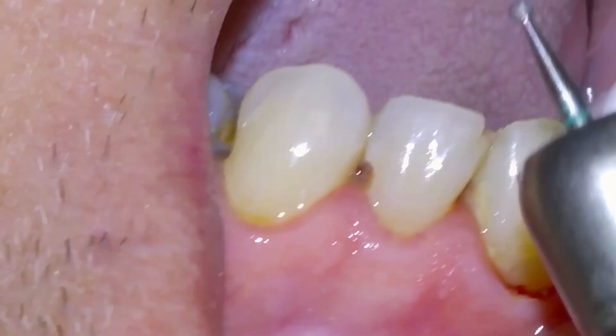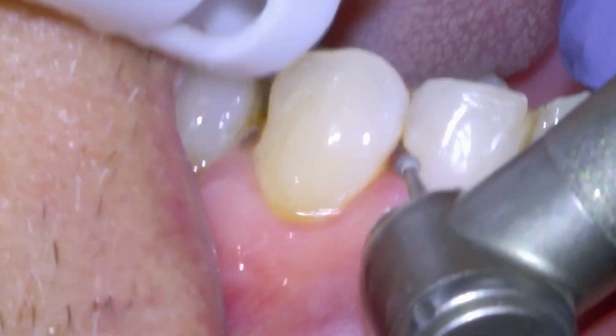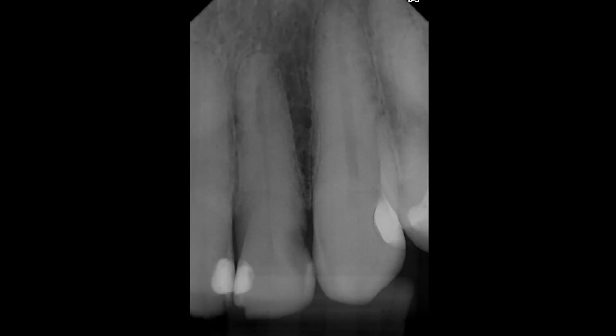Dr. Tanner Dobson here. In this video we're going to be going over a dental restoration that we did for a patient who ended up developing a pretty large cavity in their lateral incisor. Before we get into the clinical footage, here's an x-ray showing this large dark spot that has developed between the teeth — a large cavity that is getting pretty close to the nerve.